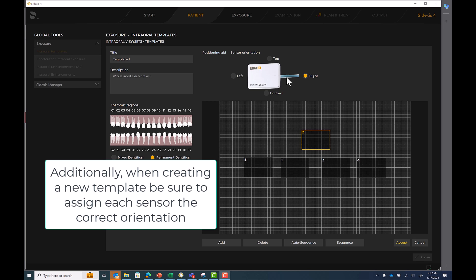Additionally, when creating a new template, be sure to assign each sensor the correct orientation.